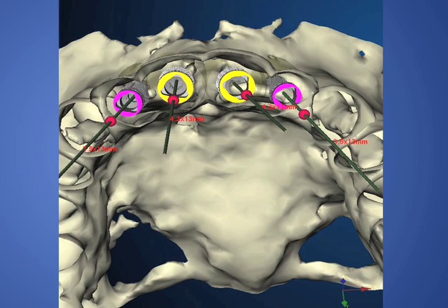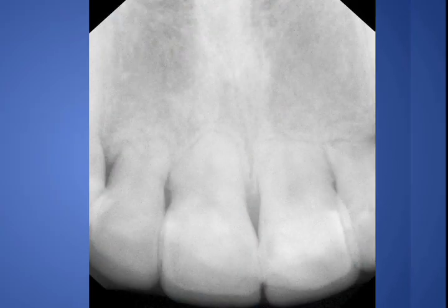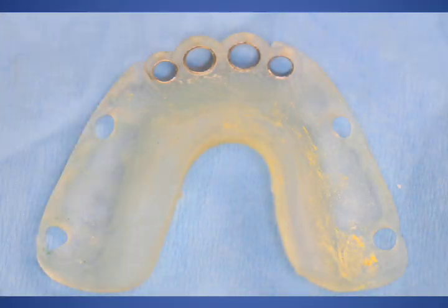However, Nobel Guide tells us that placing implants in immediate extraction sites is a difficult, if not challenging, endeavor. We knew preoperatively that the roots of the teeth had resorbed significantly, so we felt we would be obliterating the sockets completely in the placement of the dental implants. But first and foremost, we had to design a surgical guide that would allow us to correctly place the Nobel BioCare Replace Select dental implants in a relatively tight area.